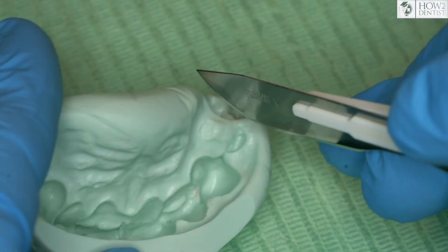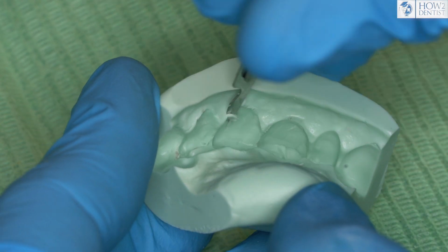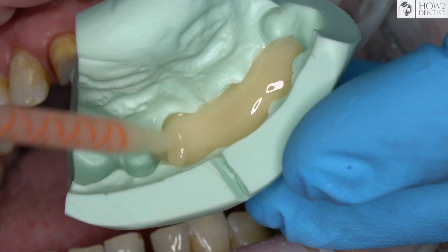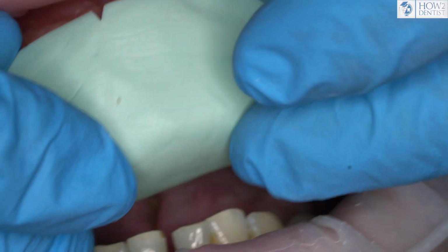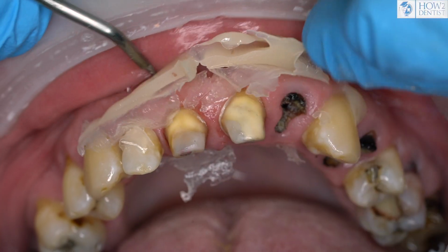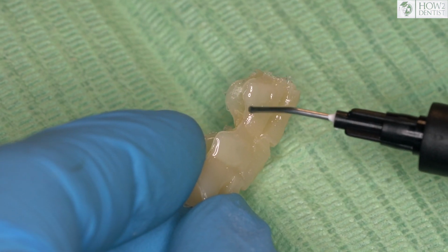We prepare the silicone key and give a little thickness at the cervical line in order to get a small hypercontour, which we will then process into the normal outline of the restoration. We fill in the material for temporary crowns and position it with the help of near teeth and the hard palate already directly in the oral cavity. We wait for polymerization according to the instruction, but not complete, so that later there would be no problems with extraction. We take out and process the temporary crowns.